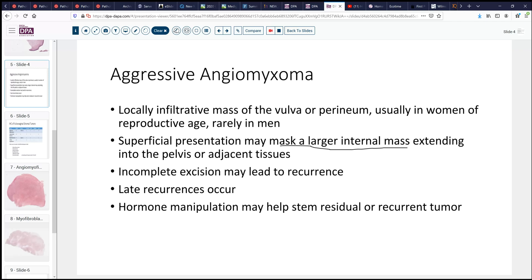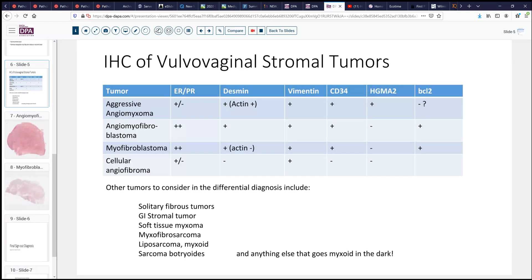Should they recur, however, sometimes hormone manipulation may help because these tumors tend to be positive for a number of hormonal markers. There are other tumors that enter into the differential and can be confusing because the names are somewhat similar. We have the entity angiomyofibroblastoma, which can also be hormone positive, Desmin positive, and Vimentin CD34 positive, and can have some of the same features of aggressive angiomyxoma.